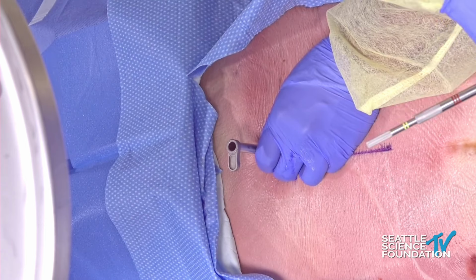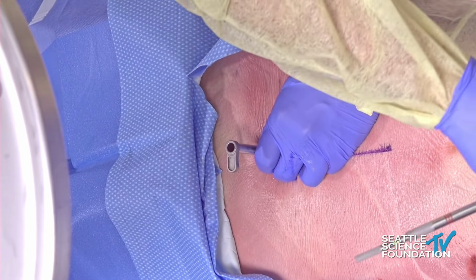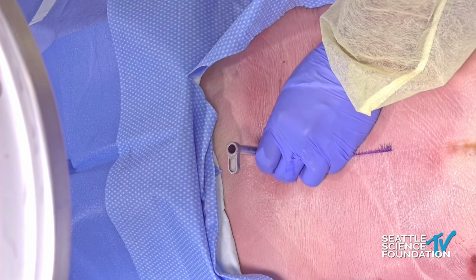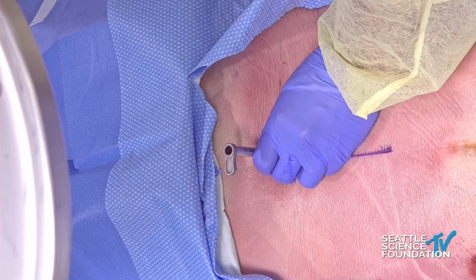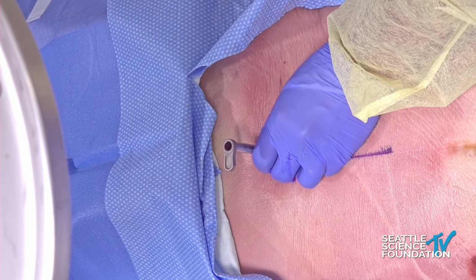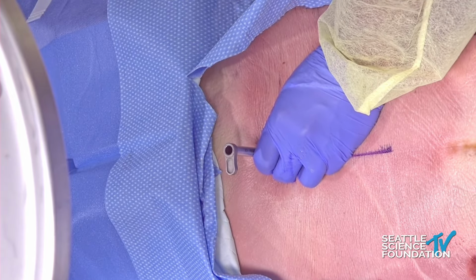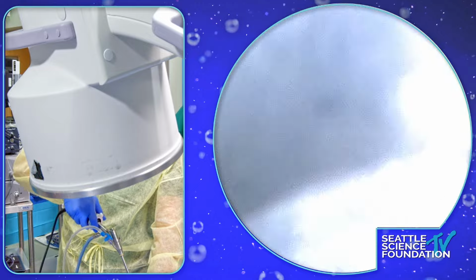And we talk about the imaging, palpation, and visualization. That trifecta is pretty much the basis for all endoscopic spine surgery. You have to use fluoro to kind of localize where you are, use your hands to confirm that you feel bone, because bone is home for the orthopedists, and then visualization is the last part.